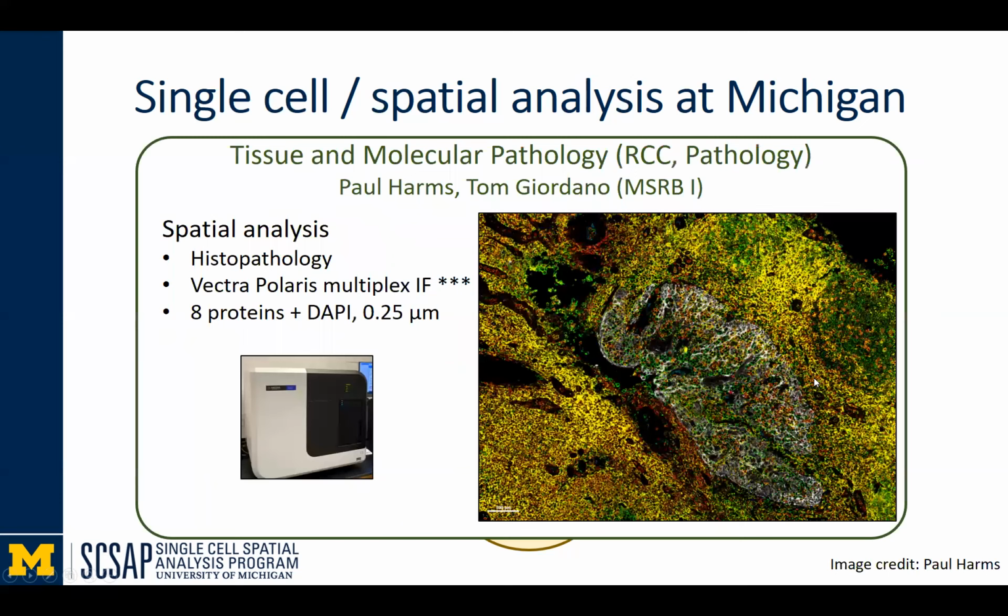That relates fairly closely to the tissue and molecular pathology core, supported again by the Rogel Cancer Center, but also very tellingly in the Department of Pathology, where Paul Harms, like myself a pathologist, is applying a particular platform of spatial analysis.